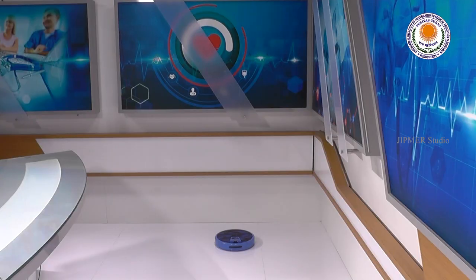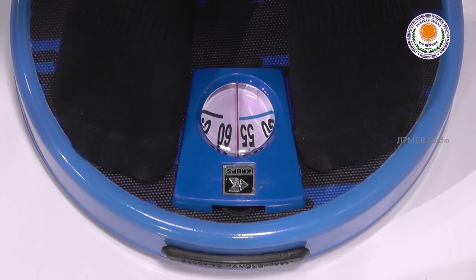Place your weighing machine on a flat and hard surface and stand straight while checking your weight. Don't lean forward or backward while measuring. You can ask a family member to read the value from the weighing machine instead of looking at it by yourself.